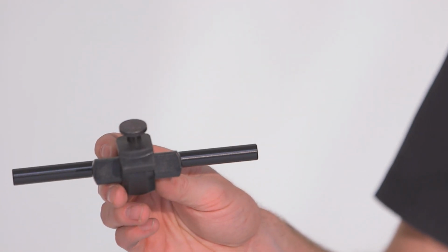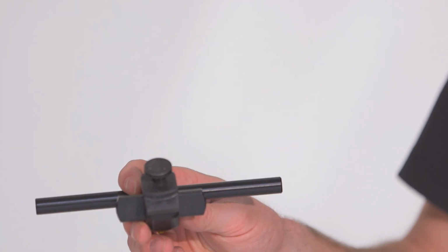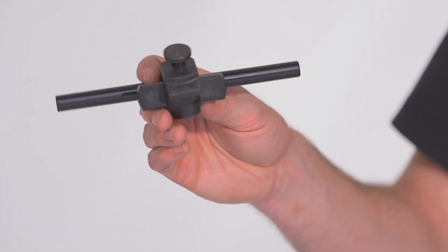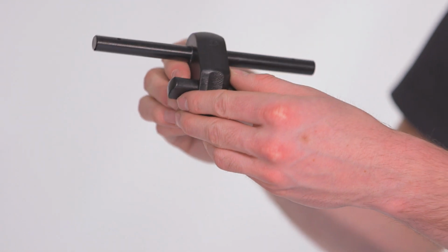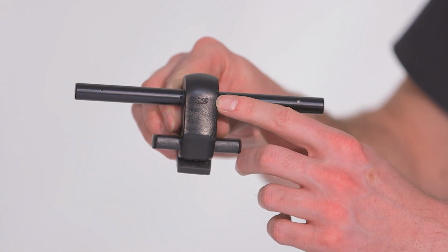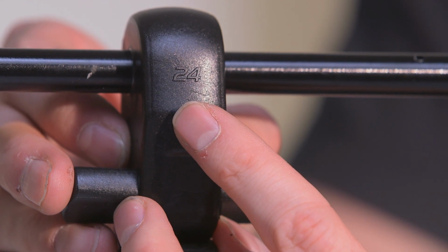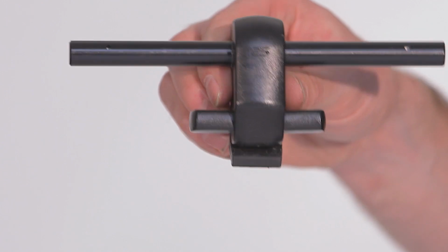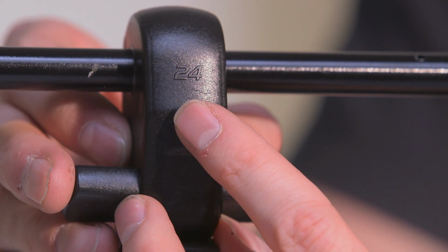First, you'll want to verify that you have the correct folder adapter attachment for the wheelchair you are attaching the SmartDrive to. This is important because you want to be sure to orient the drive unit at the right angle for ideal traction during use. Each attachment is labeled on its bottom side with either a 24, 25, or 26 to correspond to the rear wheel diameter of the wheelchair. For 22-inch wheels, use the 24.